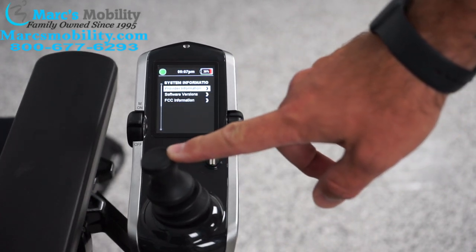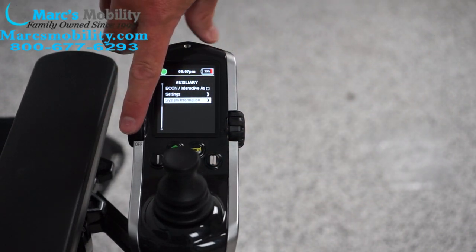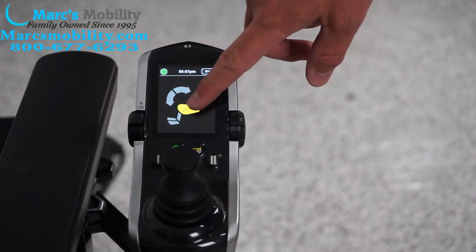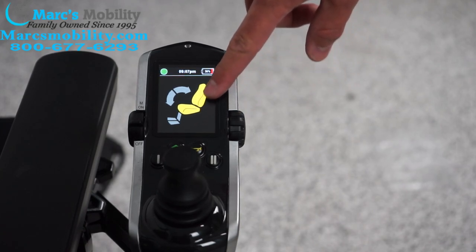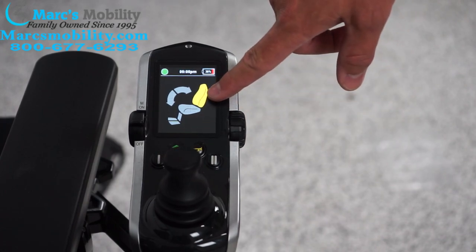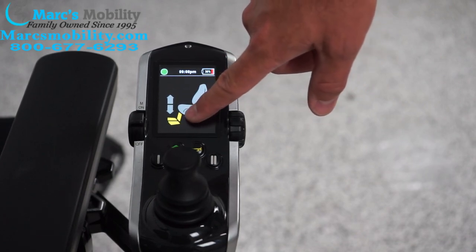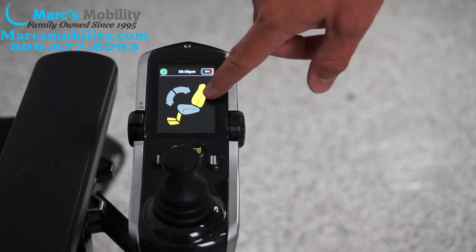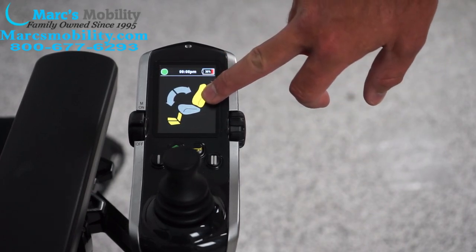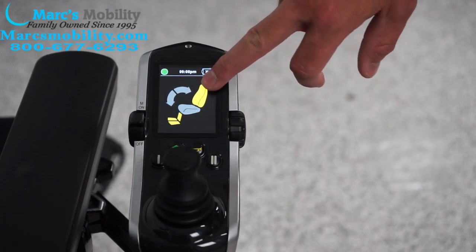Push the joystick back to the left to cycle back out of this. Push the lever forward one more time to get to your seat functions. Whatever is highlighted — if it's back and bottom — is going to be tilt, and you go left and right to operate it. You have recline, then seat lift, then the legs. Sometimes they also have recline and legs together if you want to sleep, and you press the joystick forward and back to work those functions.